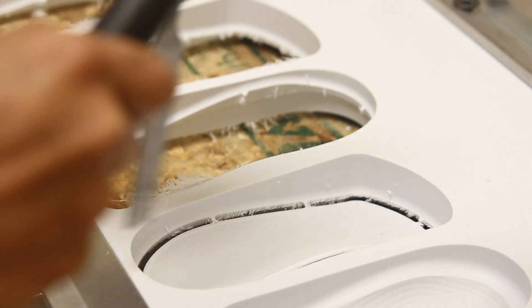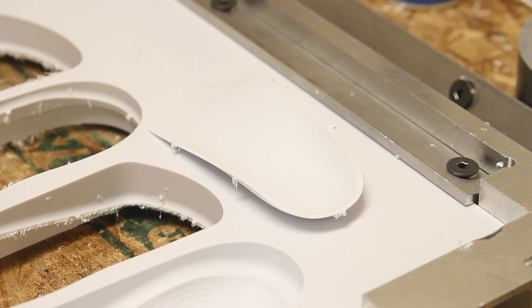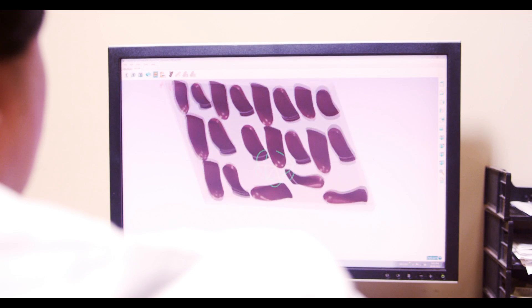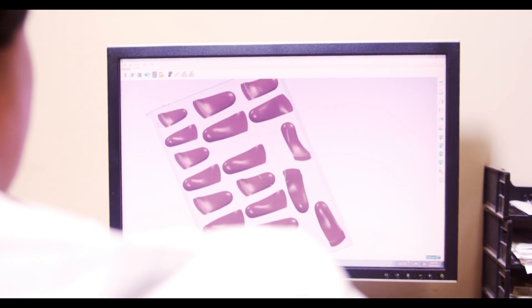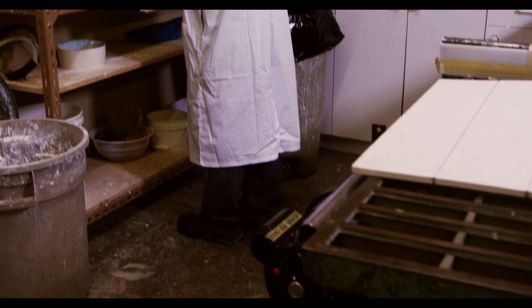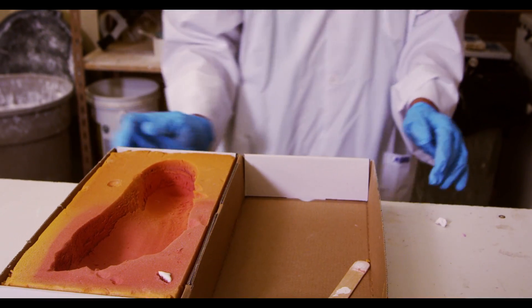Here we see the technician removing the direct milled orthotic from the block. The orthotic is now ready to move on to the grinding section. Our system is one of the most advanced methods of orthotic production available today, and its precision and accuracy are unrivaled by any other process, either digital or traditional.